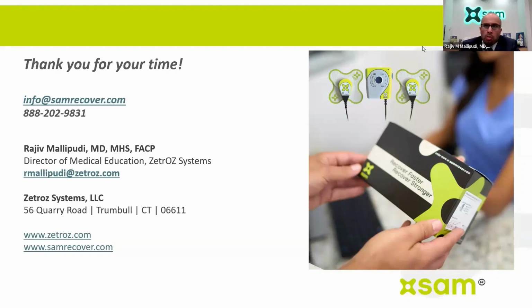All right, so in summary, nothing directly on any devices, nothing to be used on any area or limbs that specifically have peripheral vascular disease, and do not apply it on any solid organ cancers.